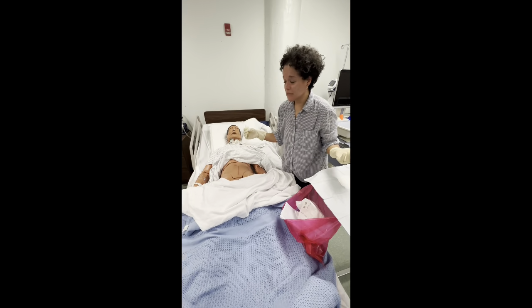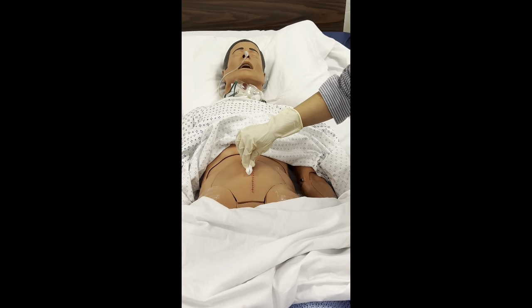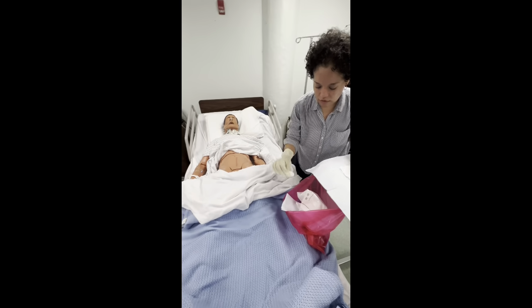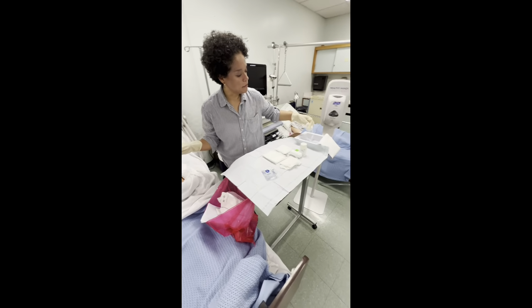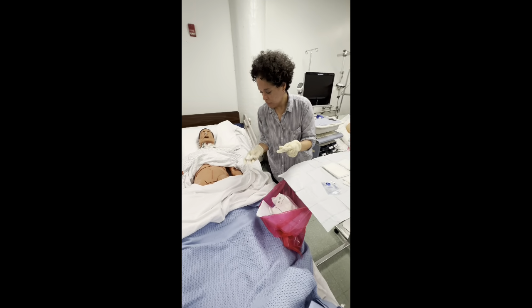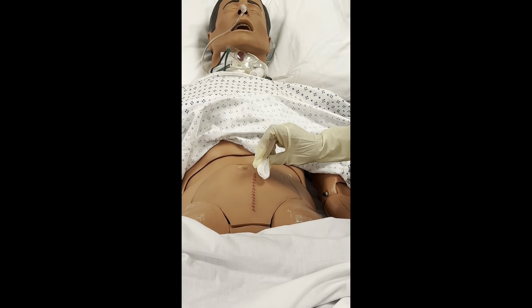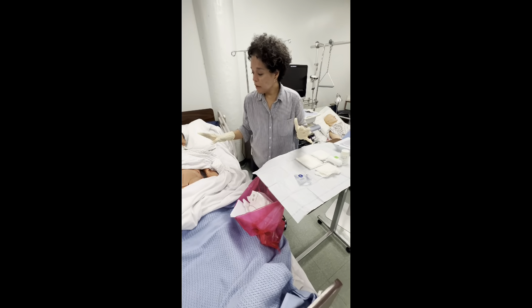Okay, so now with my second gauze, I'm going to clean distally. So that's going to be on this side, close to the incision. Away from you. Good. And trash. Excellent. Now with your final gauze here. Good. You're going to clean proximal. So it's on this side. Very good. Excellent. Okay. So now we have cleaned the site.